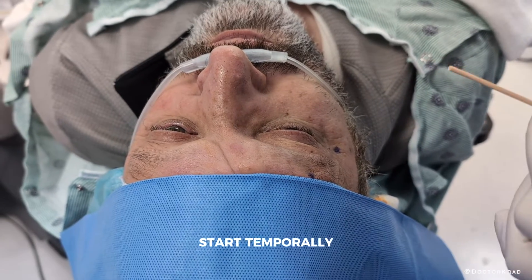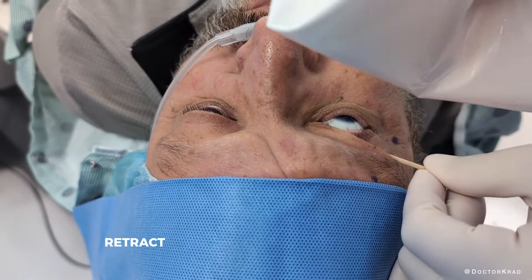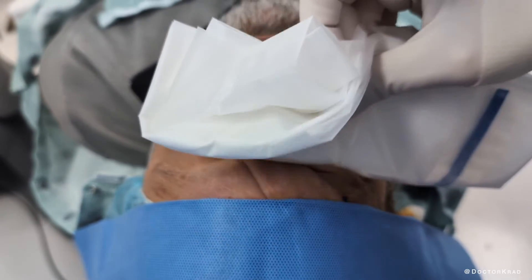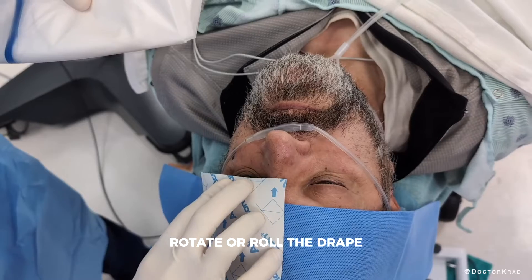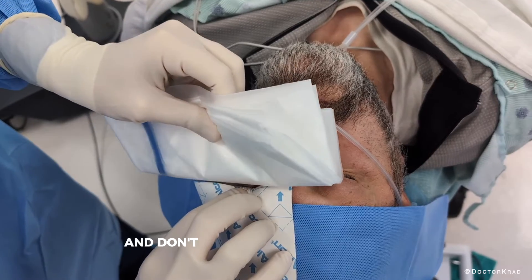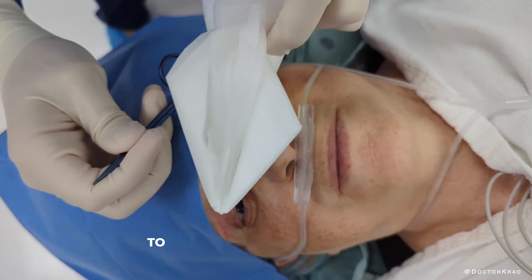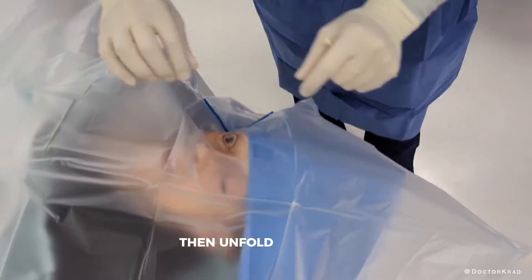Start temporally. Bring the drape over the eye. With the drape, retract the lower eyelid down — the drape rigidity from the fold is helpful here. After you retract the lower eyelid inferiorly, rotate or roll the drape superiorly over the upper eyelid. Don't unfold the drape quite yet. Before you do that, press down on the adhesive portion of the drape to make sure it has completely apposed the underlying skin. Then unfold the drape.